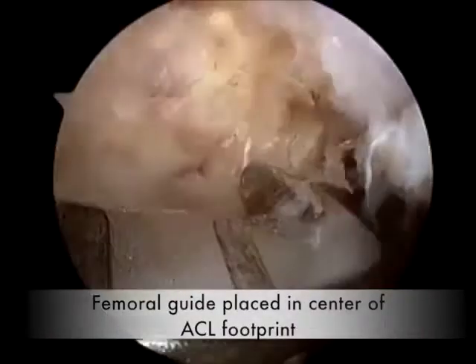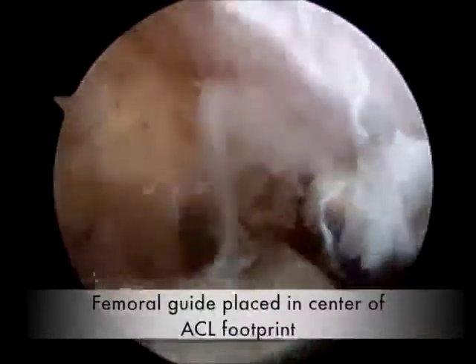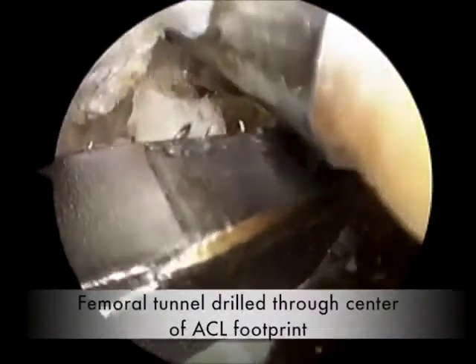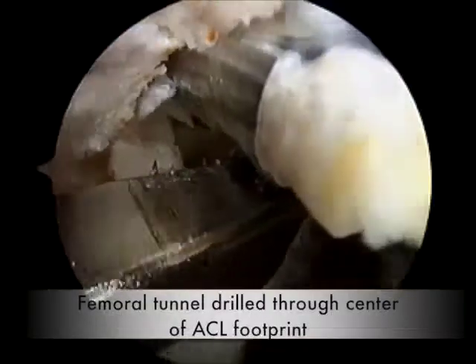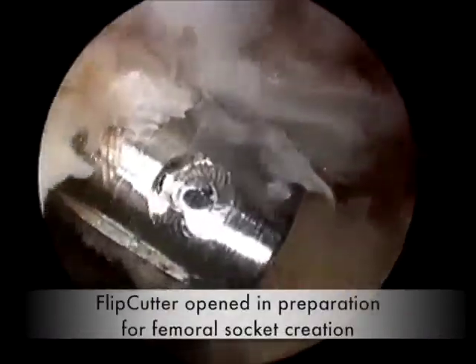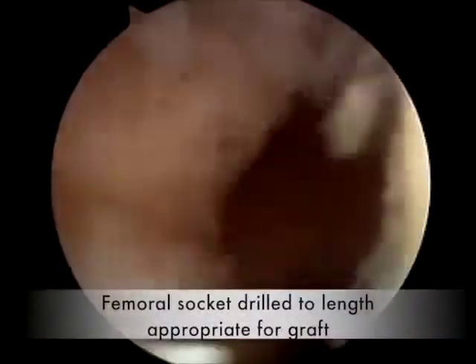Again, with the arthroscope in the anteromedial portal and the femoral guide for the retrocutter through the anterolateral portal, the guide is placed exactly where we would like, in the middle of the ACL footprint, and the retrocutter is drilled very precisely into this location. The cutter is flipped, and then the socket is made to the desired depth.